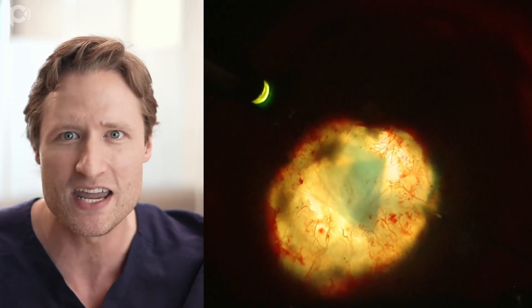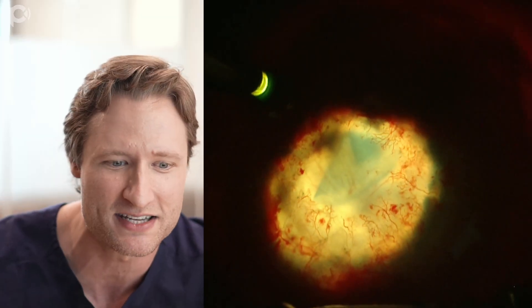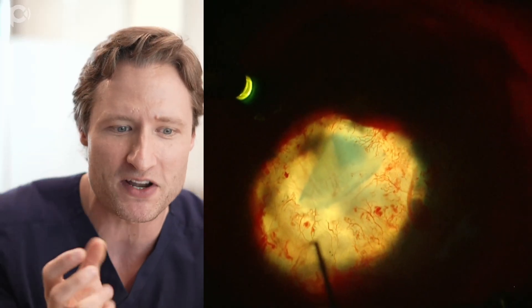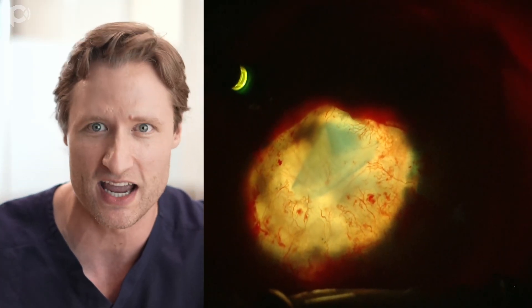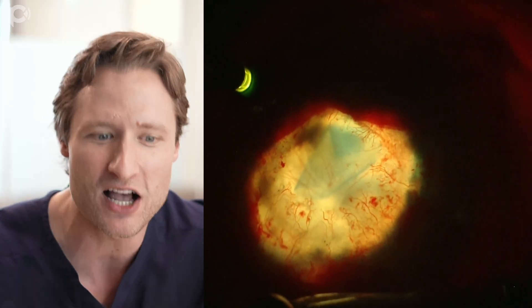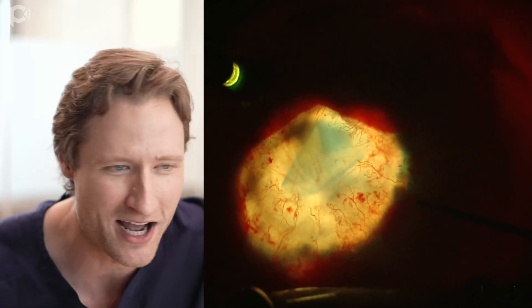Here I still have this vaguely origami-folded graft in a cramped anterior chamber. But right there - as I just tumbled the graft - I can see this edge kind of curling up towards me. And that is an important indicator that the graft is right side up. That was a lucky, fortuitous occurrence where I can tell the graft is right side up.